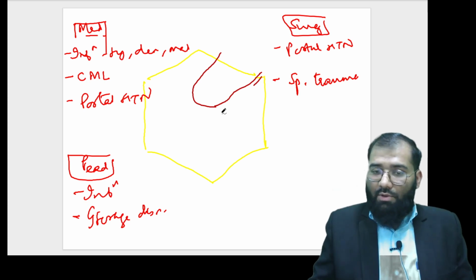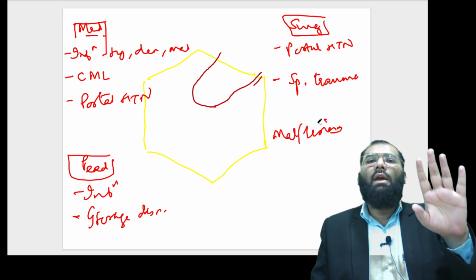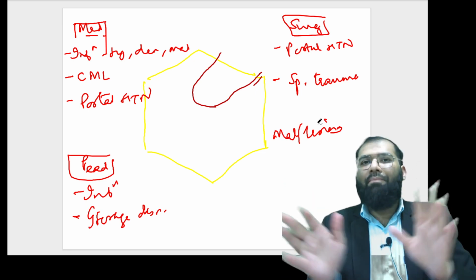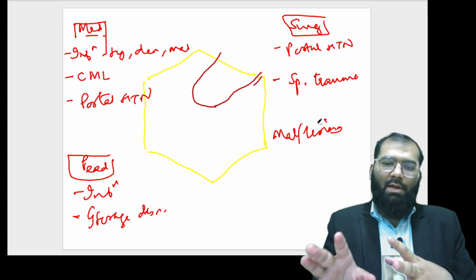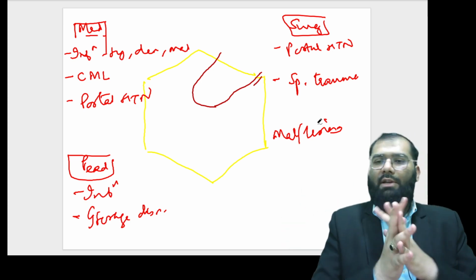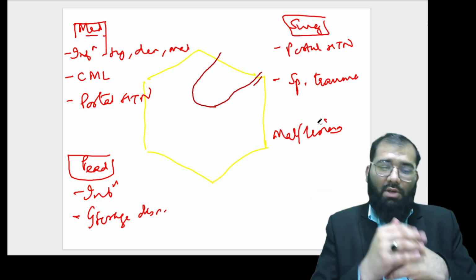When it comes to thinking of malignancy or lesions in the spleen, the most important lesions are hemangiomas and abscesses. Metastasis is more common as compared to primary lesions of the spleen. The most common primary lesion is the benign hemangioma; among malignant lesions you get lymphomas.